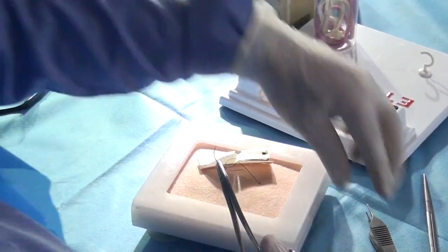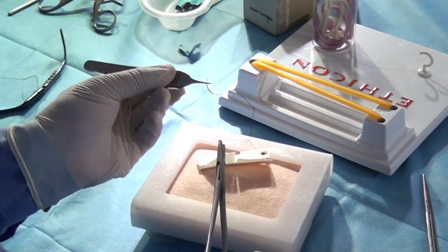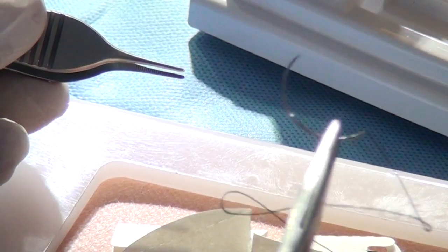What is posterior or closer to swage? Watch it. Needle can be seen. It's black. Yes, good, thank you. Now that's the swage where the thread is attached. And that's a tip. And that's a body. So at the junction of 1/3 and 2/3, you grab the needle. Lock it.